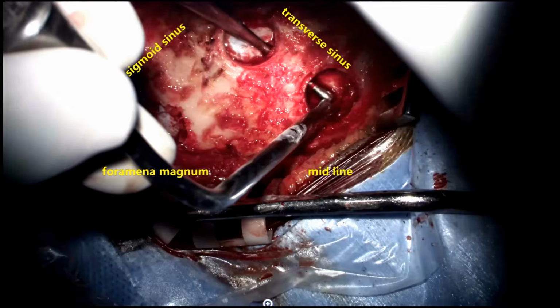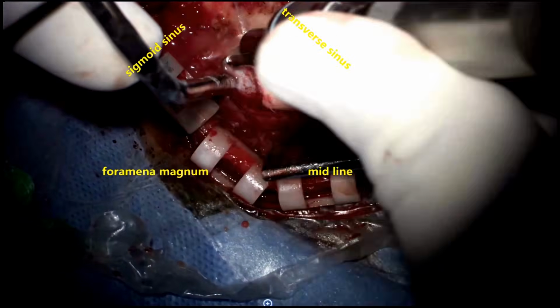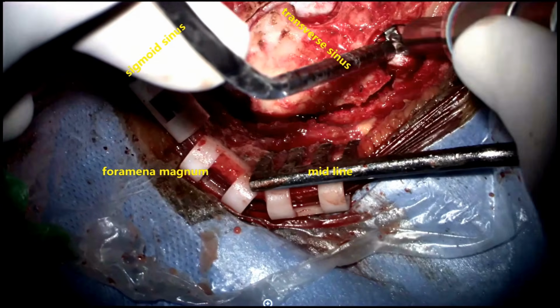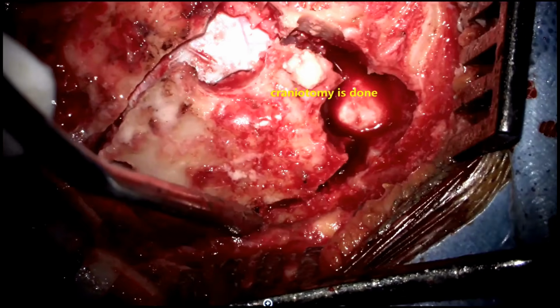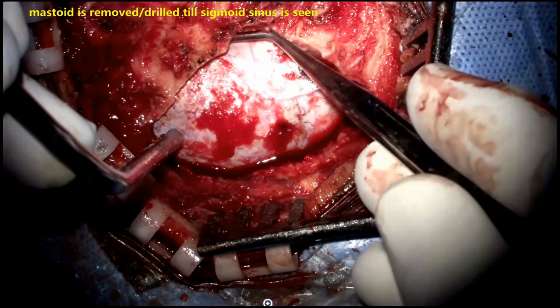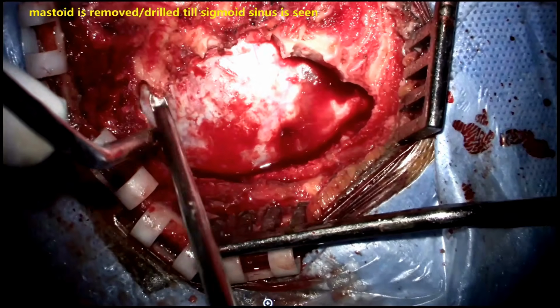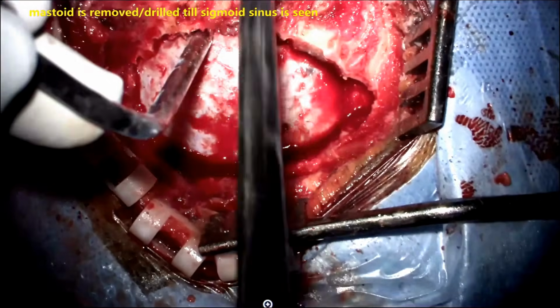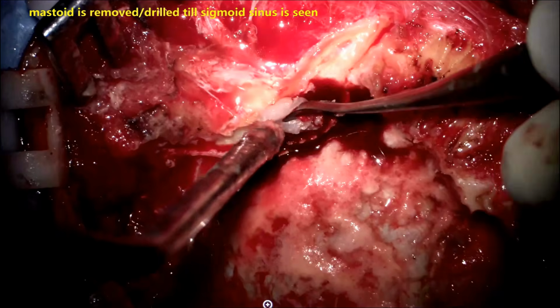We prefer to do retromastoid suboccipital craniotomy. The scalp flap is raised in a semilunar fashion and 3 burr holes are made and they are connected with the cutter, and the bone is elevated and taken out. Next, we drill the lateral part of the suboccipital craniotomy till we see the sigmoid sinus laterally and exposed.